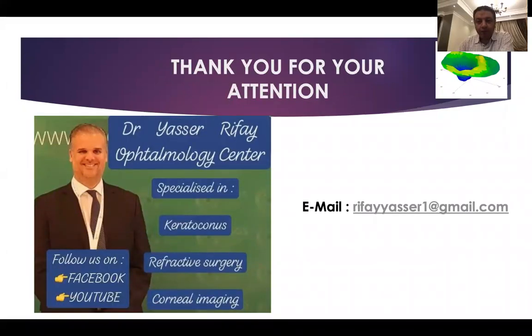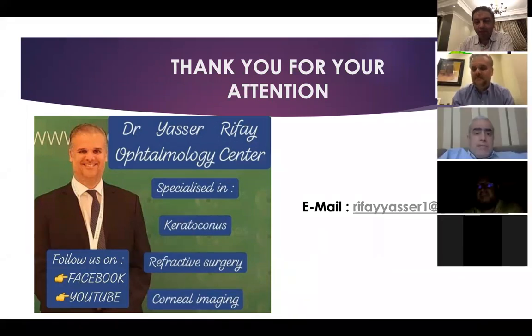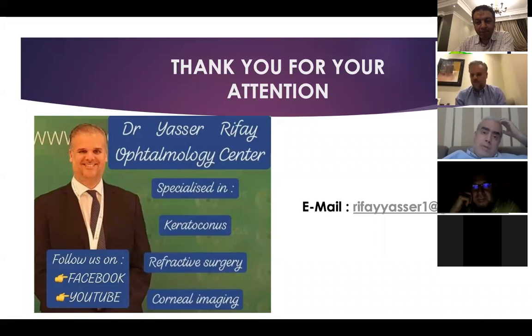Thank you, Dr. Yasser. Honestly, you are giving us a very innovative idea, but unfortunately I really disagree about the case that you have presented. I don't think that epithelial mapping can change the curvature of the cornea to an extent to suspect keratoconus in a case like this. I do agree that if you have a posterior elevation, even if the least amount, you might diagnose, and epithelial mapping can help you in diagnosis of early keratoconus.